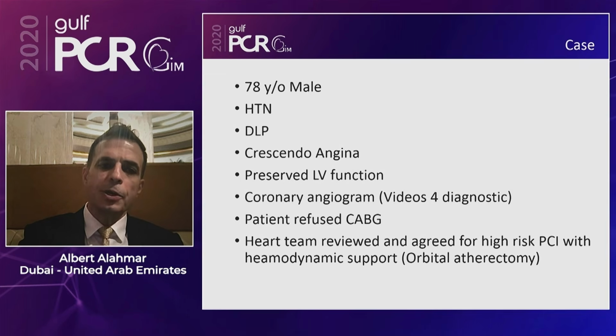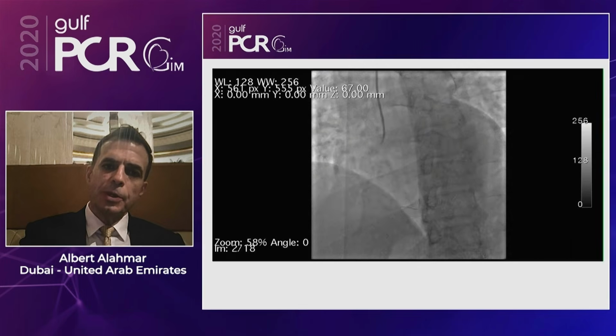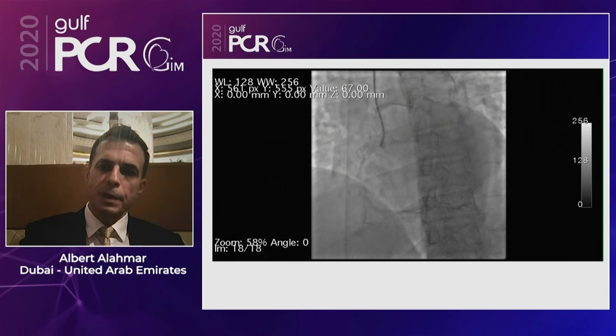However, he categorically declined, and the heart team reviewed the images, and we agreed that we have to do something for him. Therefore, we agreed on high-risk PCI with hemodynamic support. I'll show you the images. I think they are playing now.